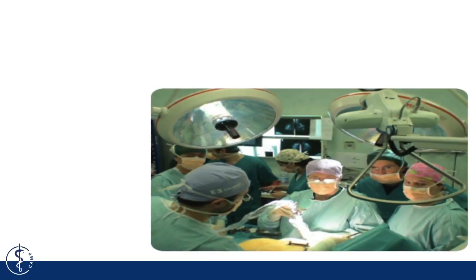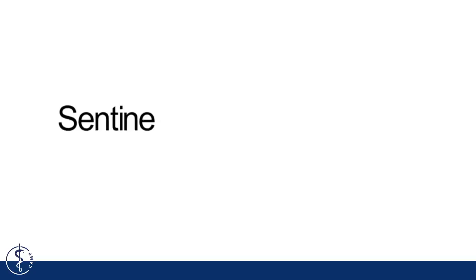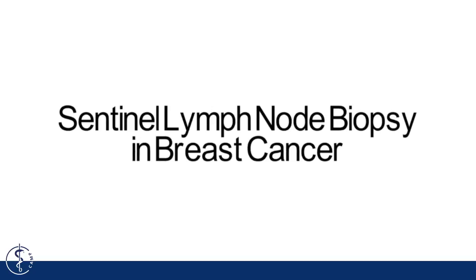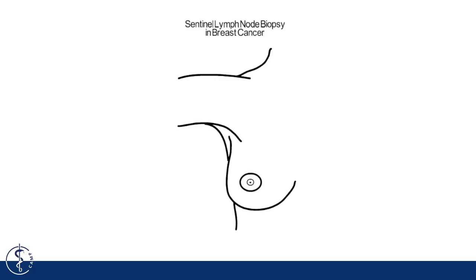Let's look at an exemplary clinical application where nuclear imaging can improve the clinical outcome: sentinel lymph node biopsy in breast cancer. During routine checkups, a woman gets diagnosed with early-stage breast cancer. The tumor is still comparably small, maybe not even palpable yet. However, the treatment depends on the exact stage of the cancer.